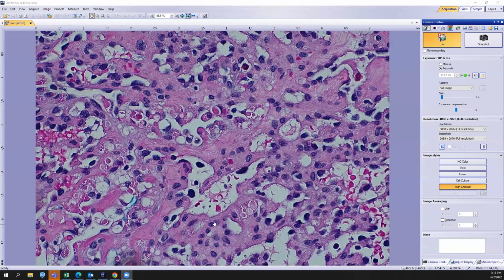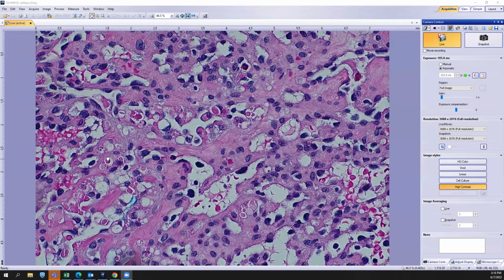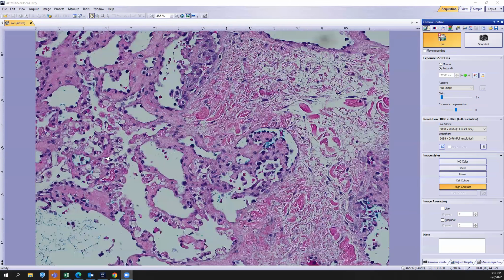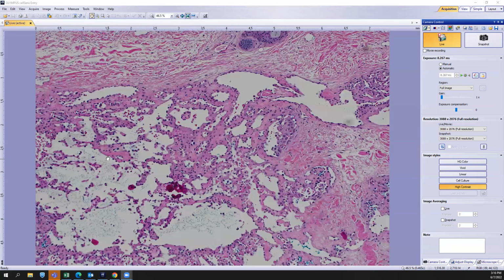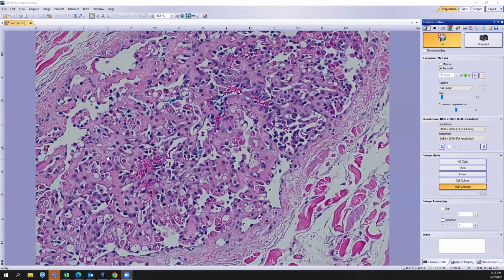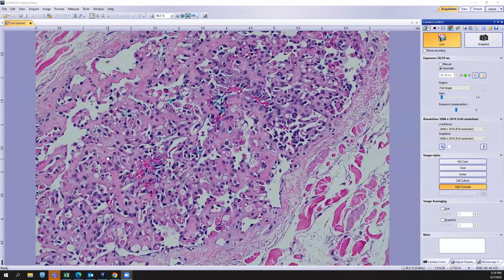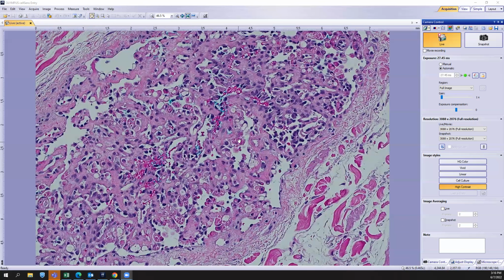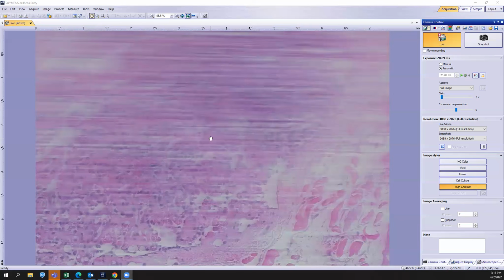And they're different than the erythrocytes, actually, which you'll be able to appreciate within the lumen. So these eosinophilic inclusions are kind of more separated back into the stroma in many of these areas. And so just kind of scrolling around to show you more examples of that. One particular area had a nice mix of a solid component of this, what I'm going to call hemangioma. And you can see this kind of plump endothelial architecture. Again, more of those eosinophilic droplets.